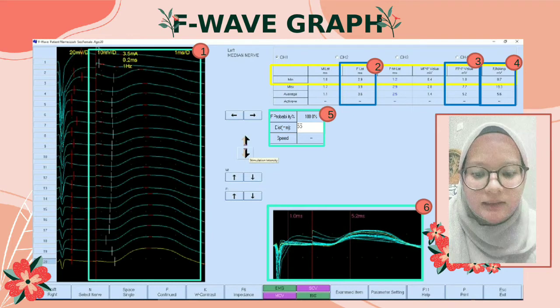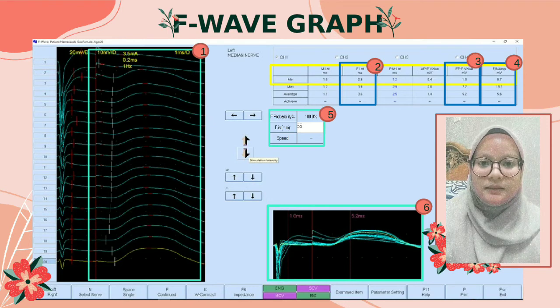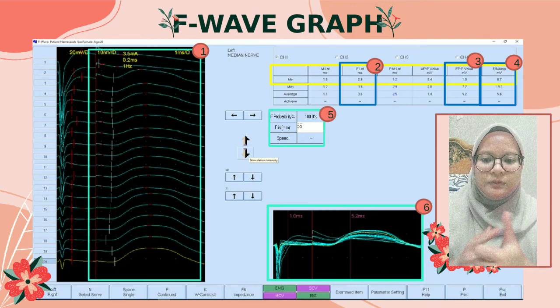So the last one is the interface displaying the overlapping F waves with the measuring lines. These results happen when the EMG electrode gives 3.5 milliampere current to the nerve. The anterior horn cells reflect, which makes the subject's thumb move by itself.